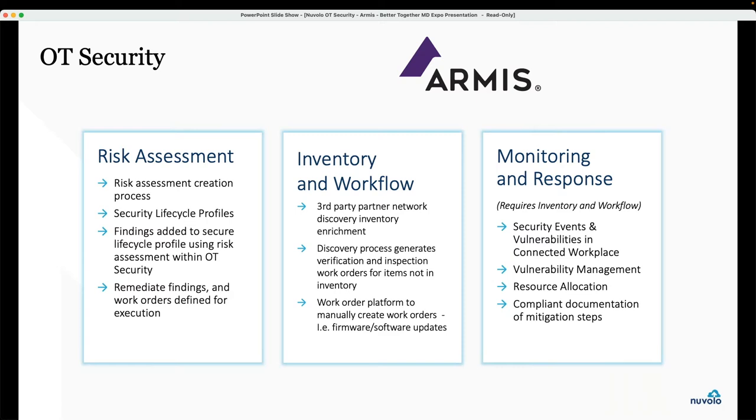Because at the end of the day, when you're working in incident response and an incident, you need to understand the context of that device. You don't want to get the call that says, you know what, just pull it off the network. That's just not workable. So for a risk assessment, I think the framework is 800-37, right? Well, 37 or 53? I think 37. Yeah. So you can actually leverage that and incorporate it into the technology to actually build a framework.